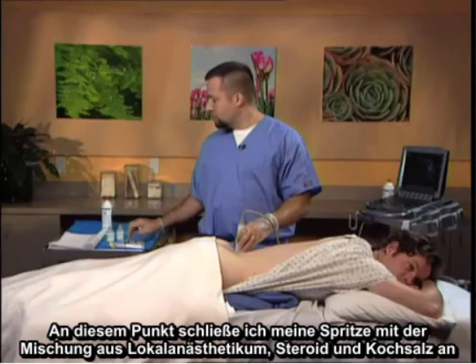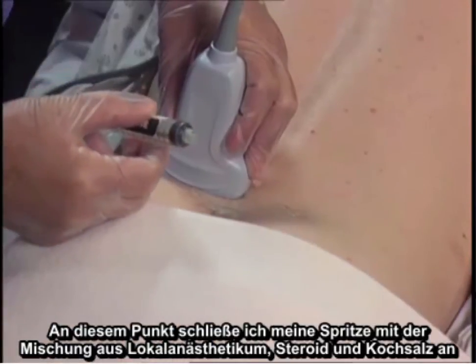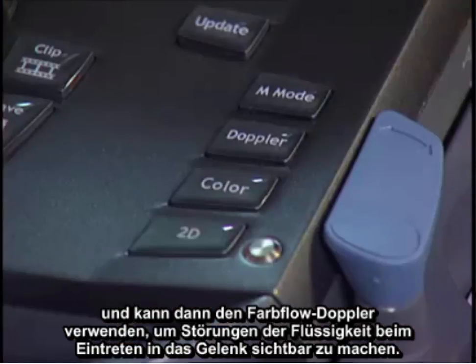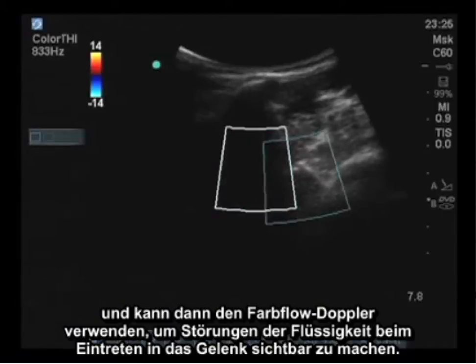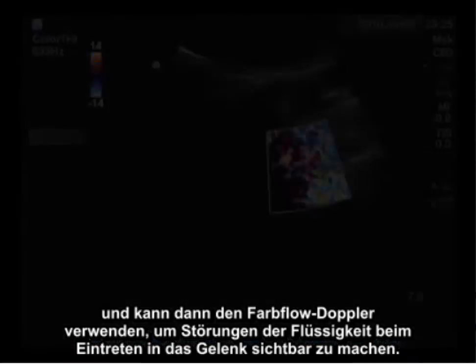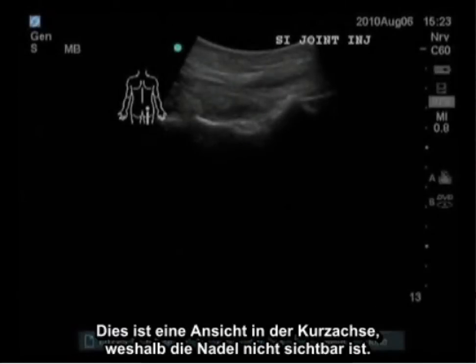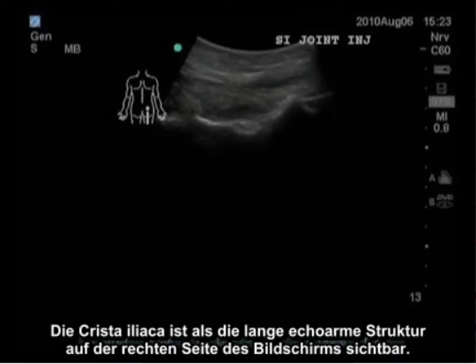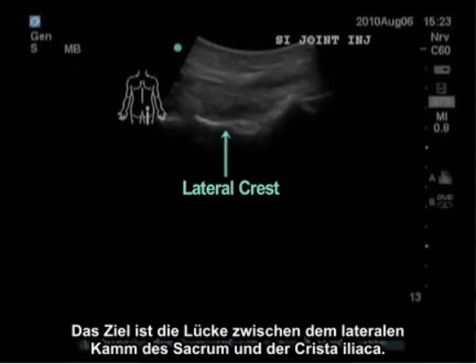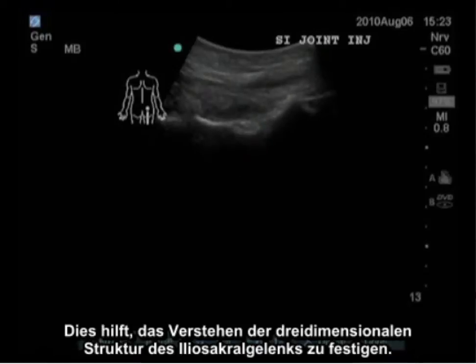At this point, I attach my syringe containing the local anesthetic steroid and saline mix, and then I can utilize color flow Doppler to actually visualize perturbations of the liquid as it enters the joint. The view is in the short axis, therefore the needle is not visible. The iliac crest is visible as the large hyperechoic structure on the right of the screen. The lateral crest of the sacrum is visible below. The target is the void between the lateral crest of the sacrum and the iliac crest. This helps solidify understanding of the three-dimensional structure of the sacroiliac joint.